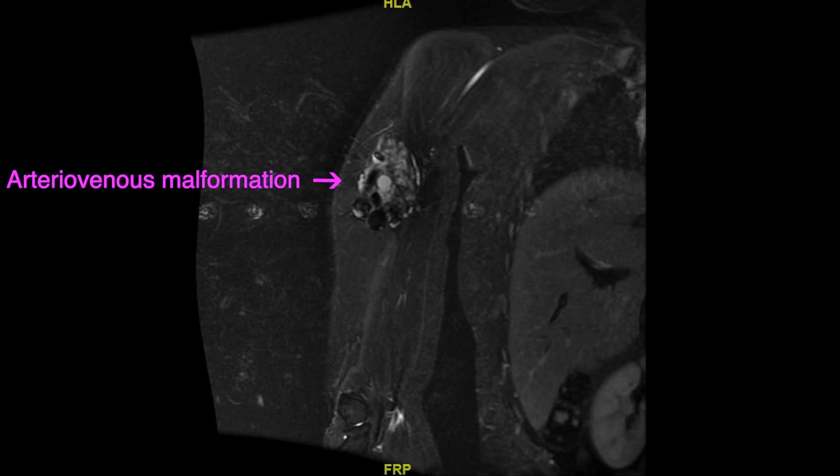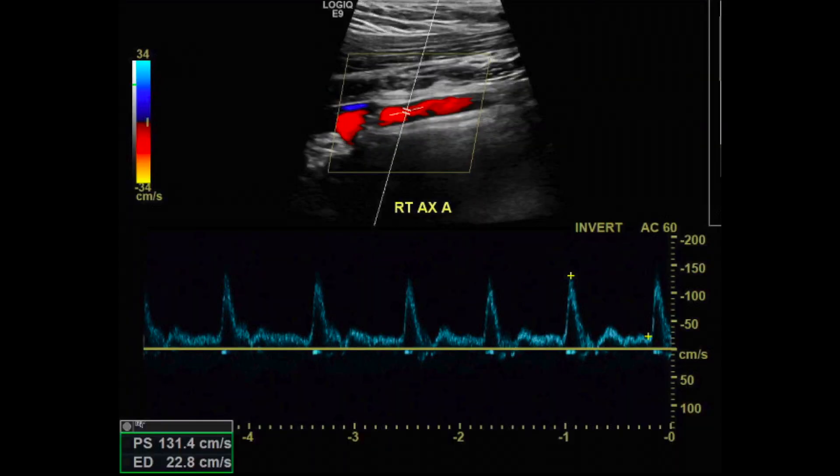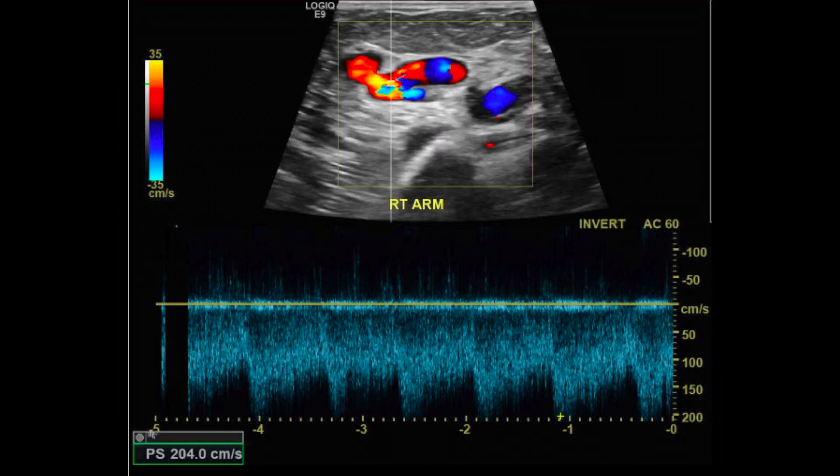Shown here is the arteriovenous malformation on an MRA. She also had an arterial duplex done that showed normal triphasic waveforms in the right axillary artery. Just distal to the axillary artery, disturbed colored flow with low resistance and high velocity waveforms, suggestive of AV malformation, were also found.